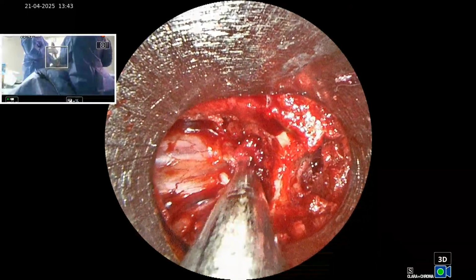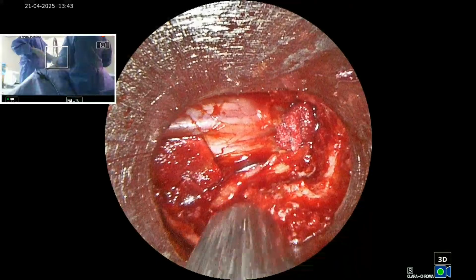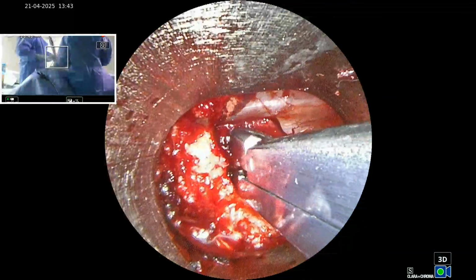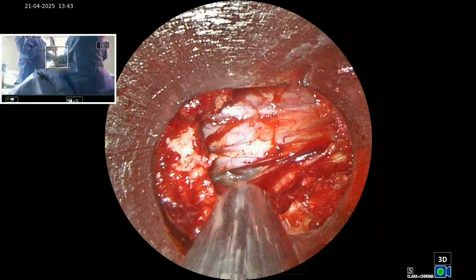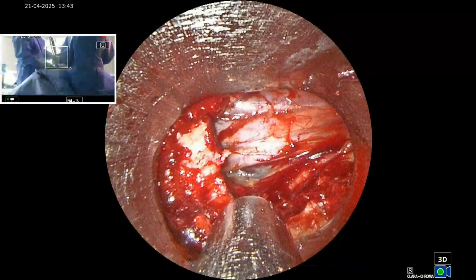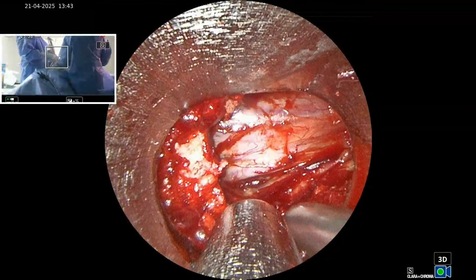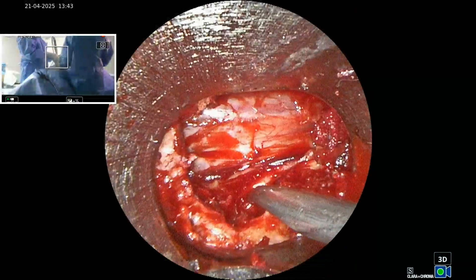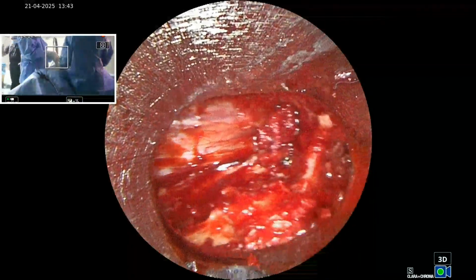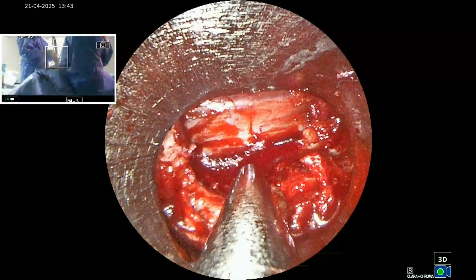So that is the confusion that came. Now the disc, sorry, spatula. I was thinking this is the nerve. Actually, this is the nerve, and another nerve is here. So this is the confusion. Maybe sometimes it comes as a conjoined nerve like this.